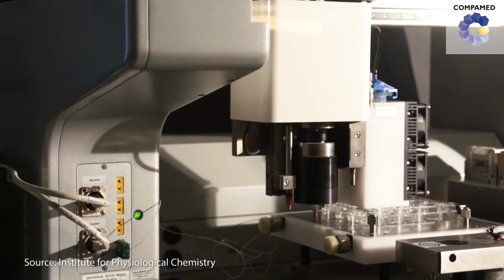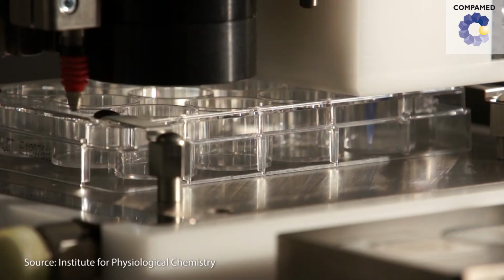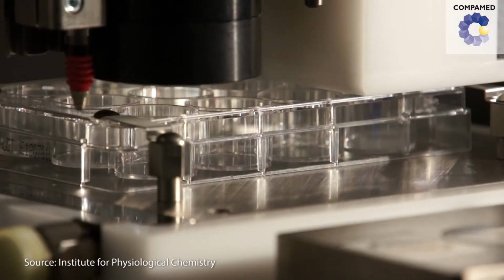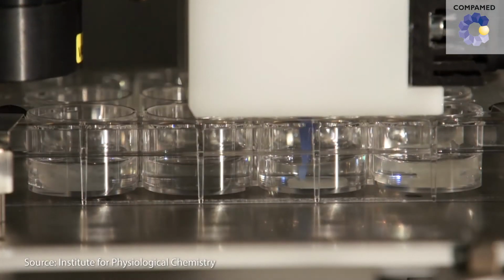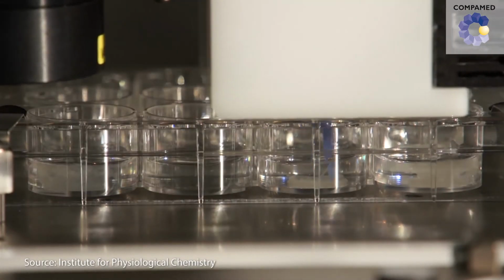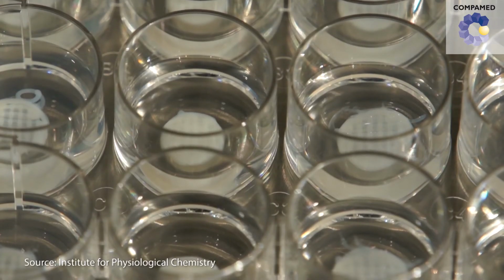The scientific and technological foundation for printed medical implants has been laid. That being said, the process still needs some improvements to ensure clinical application and ultimately approval. The printers that produce these types of implants are already available, and they can still be improved, of course. You can make the resolution higher, but the real challenge is to produce the right bioink. To do this, you need polymers that must meet certain requirements. I believe we have taken on a pioneering role in this area by discovering and copying what Mother Nature does.